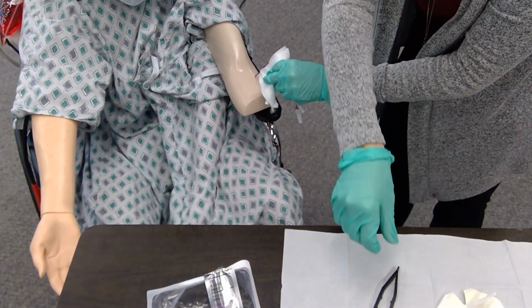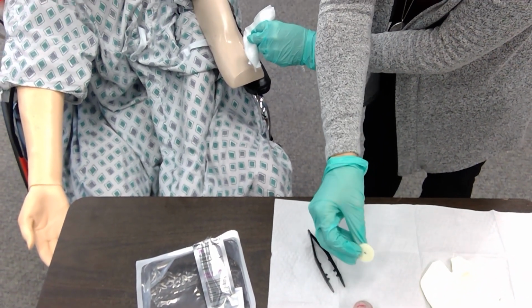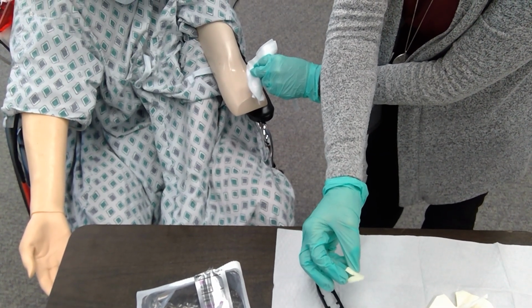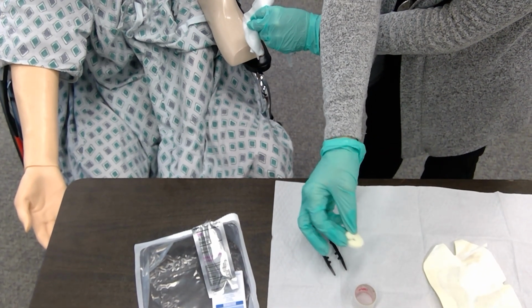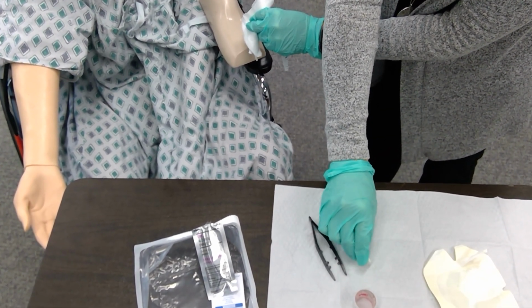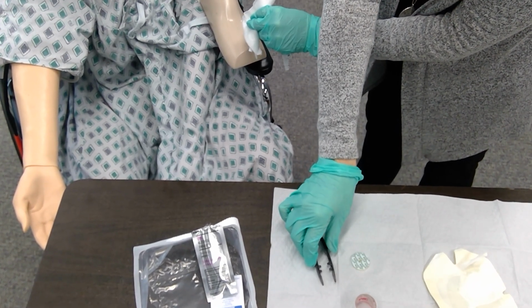Next, I need to put my bio patch on. A bio patch is impregnated with chlorhexidine. So that white right there is all chlorhexidine, and it's intended to keep the insertion site clean in that 7 days that the patient has the dressing on. There are different ways that you can do this.